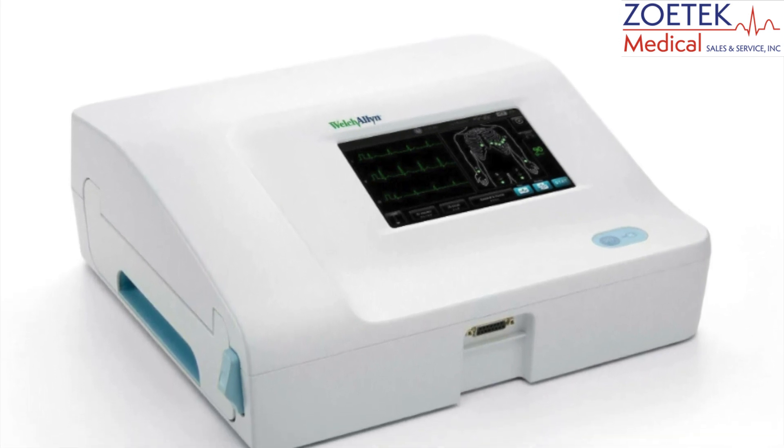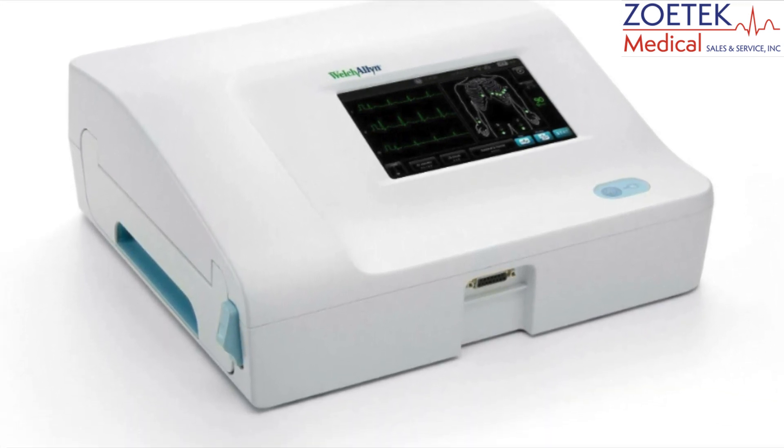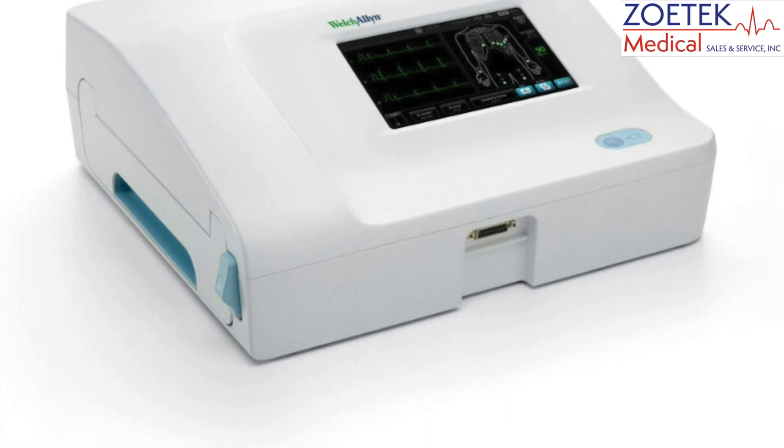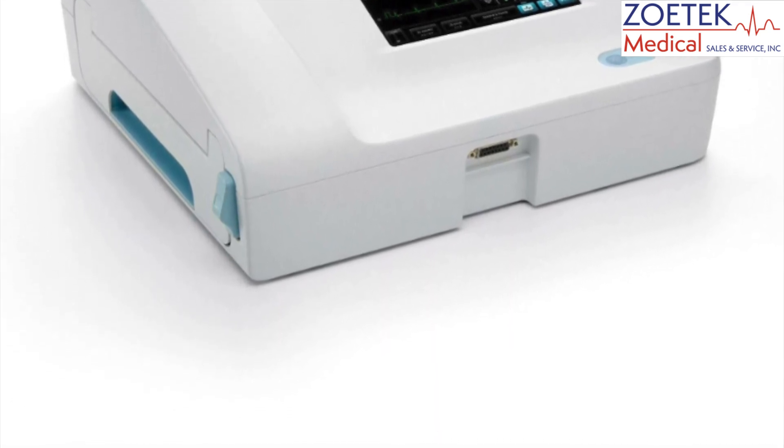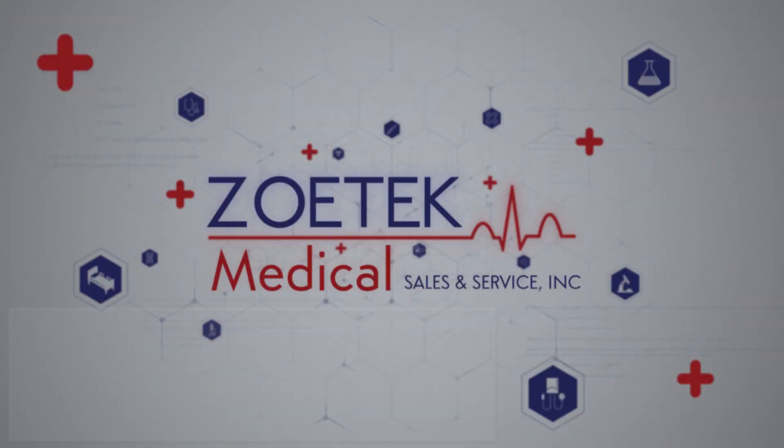On some EKG models, such as the Welch Allen CP150, once the internal battery is completely dead, the machine will not work even when plugged into the wall. At that point, the battery will either require charging or replacement before use.